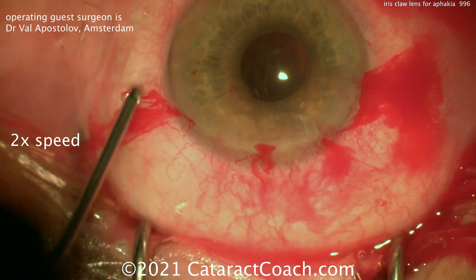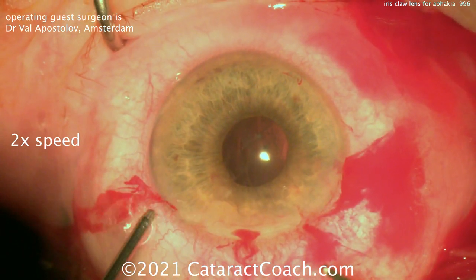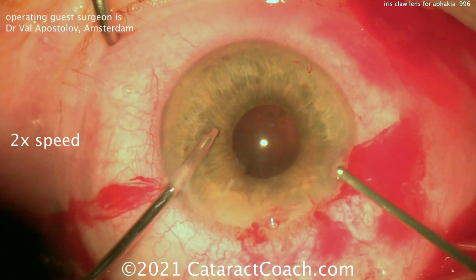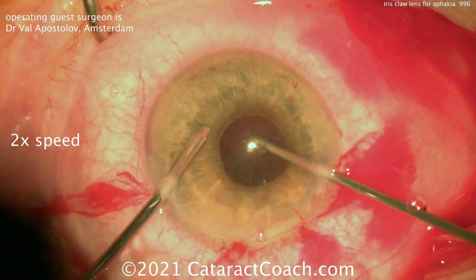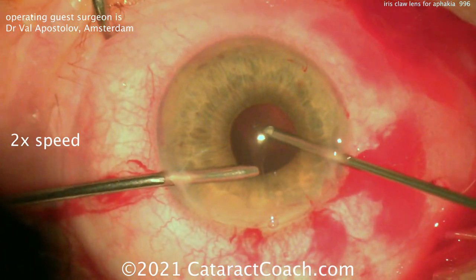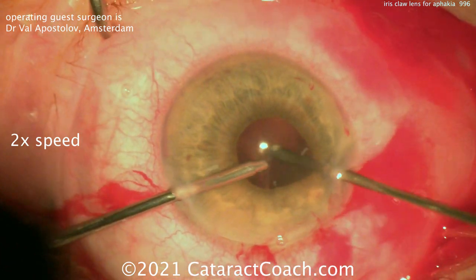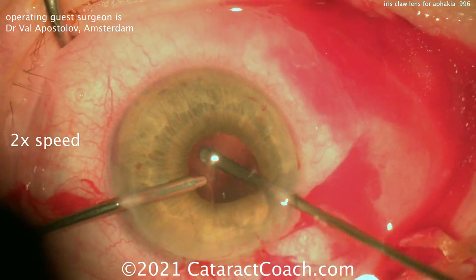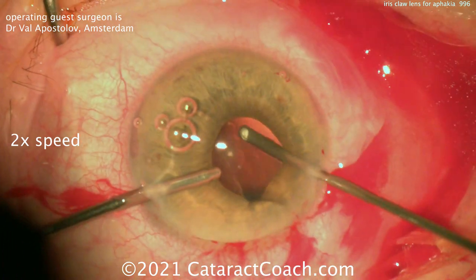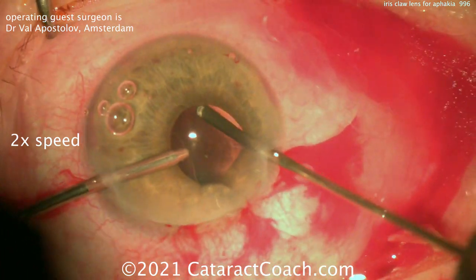Scissors were used to cut the vitreous that may have been prolapsing, and now it's definitely time for an anterior vitrectomy. You've got to be careful in these cases — you don't want to put traction on that anterior vitreous, because that can predispose the patient to retinal detachment. Here, a bimanual 23-gauge anterior vitrectomy is being performed. Make sure you clean up all the vitreous that's prolapsing through that pupil.